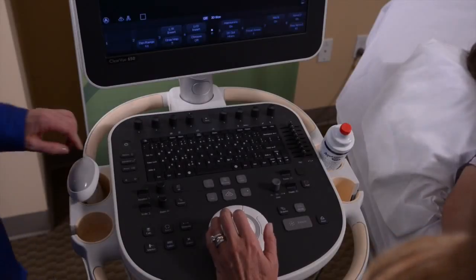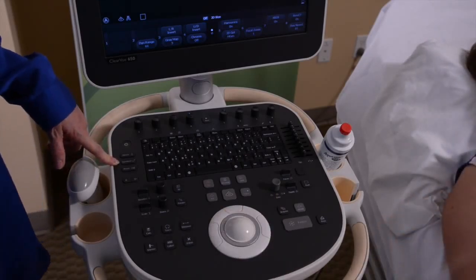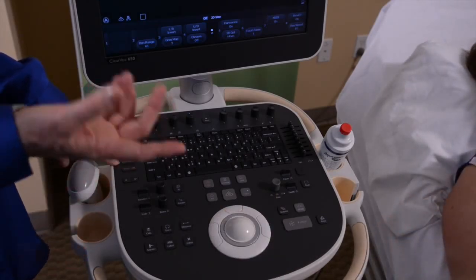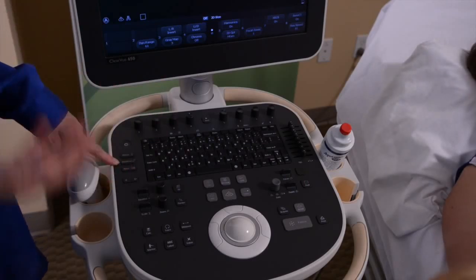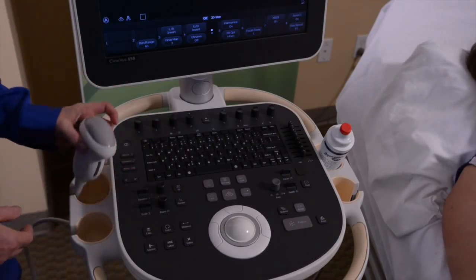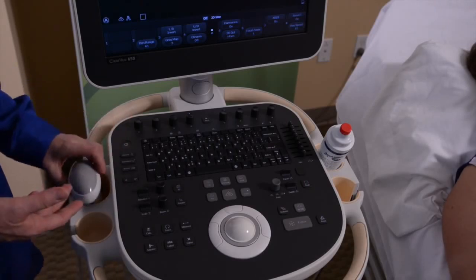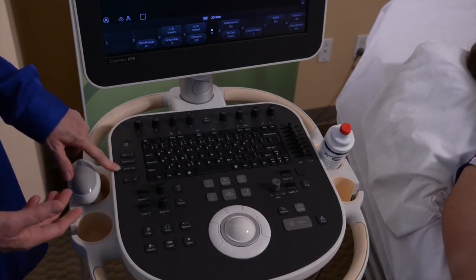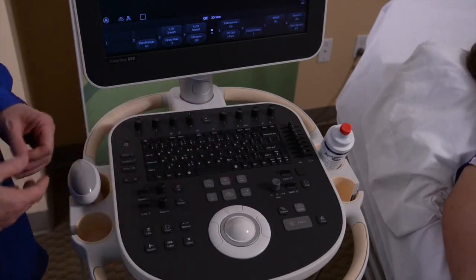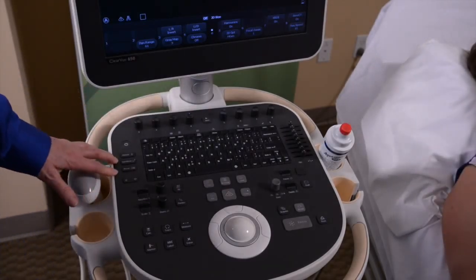Now we also have to choose the appropriate transducer. In this case we're using a C5-2, which is a good abdominal transducer. We also have the V6-2, which would be for 3D. And then we would choose the appropriate preset based upon what we're doing — today in OB. And those are the controls you have here.